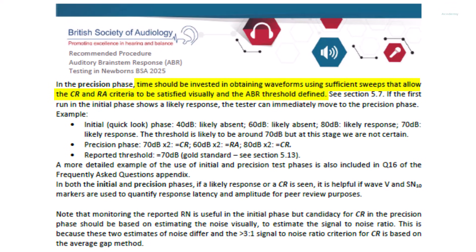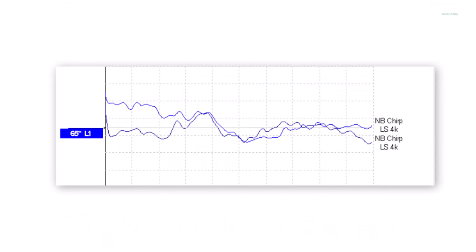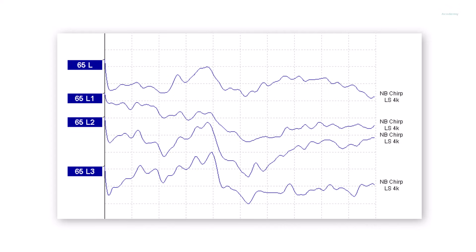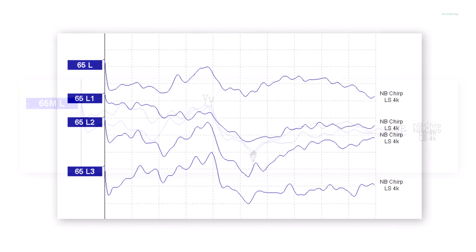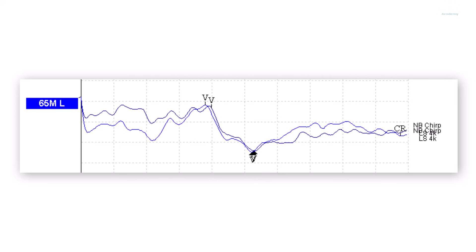In the precision phase, we will focus on establishing threshold accurately and with repeatability, in order to satisfy the definition of CR and RA, preferably with gold standard met as well. A repeat of 65 dB was tested. There was some noise between the waveforms, therefore four traces were recorded in total, with waveforms 1 and 3 added together, and waveforms 2 and 4 added together. The recommendation from the BSA is to use the merge waveforms functionality rather than the add waveforms functionality. Adding the waveforms leaves the original waveforms visible and generates a new added waveform, which can leave the screen unnecessarily cluttered. By merging the waveforms, the final merged waveforms are displayed on screen and the originals are no longer shown, but can be viewed later by simply unmerging. The end result was a set of repeated waveforms which satisfied the 3 to 1 signal-to-noise ratio requirement and definition of CR.